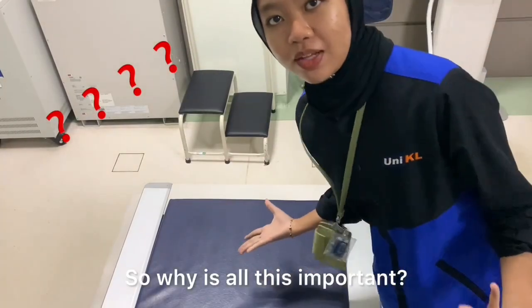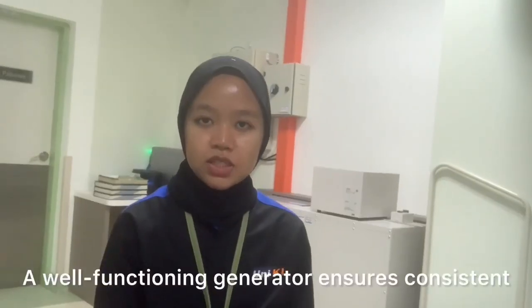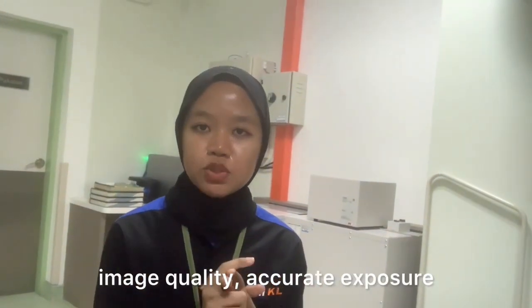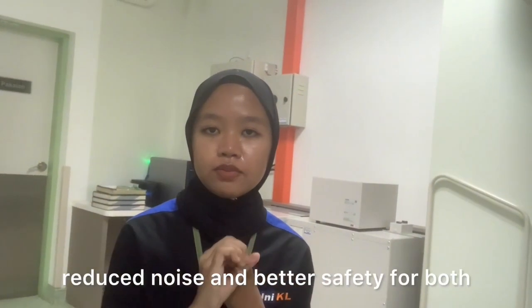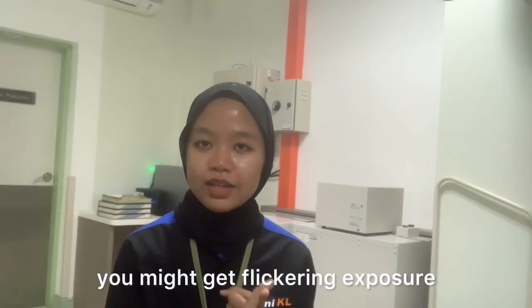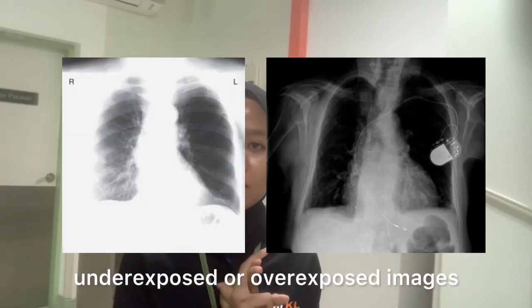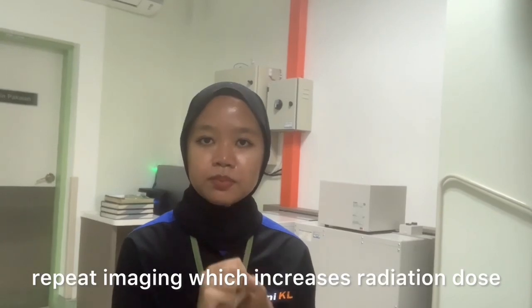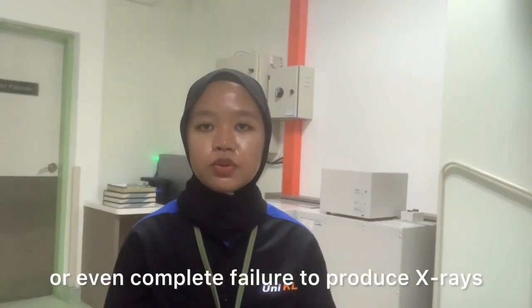So why is all this important? A well-functioning generator ensures consistent image quality, accurate exposure, reduced noise, and better safety for both patient and radiographers. If the generator is unstable or faulty, you might get flickering exposure, underexposed or overexposed images, repeat imaging which increases radiation dose, or even complete failure to produce X-rays.